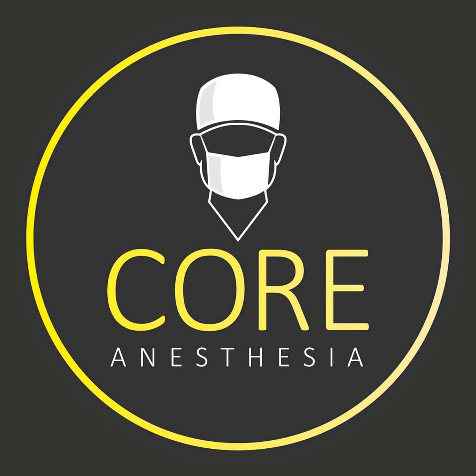Ideally, textbook wise, the patient's weight in kilograms is what's used to determine the size of the LMA you should use. For my personal practice, I feel like I weigh a lot of the height into it as well. I don't care as much about how much extra adipose tissue someone has kilogram wise, because I don't feel like that changes the anatomy of the size of the mouth necessarily. Whereas I feel like the height gives me a better judgment as to what LMA size I should use. So it's really a balance between the kilograms and the height of a patient.